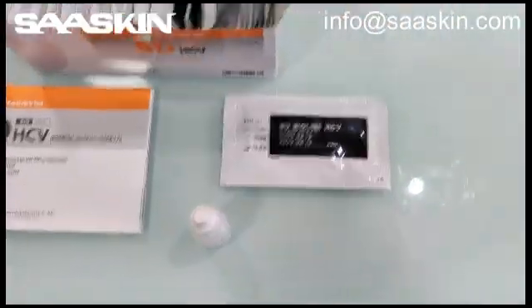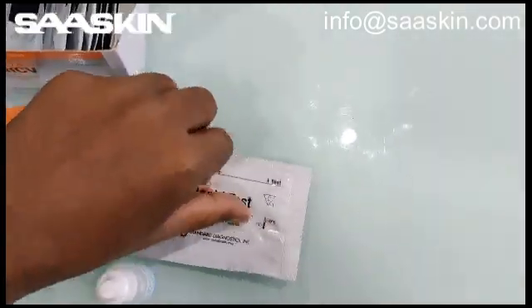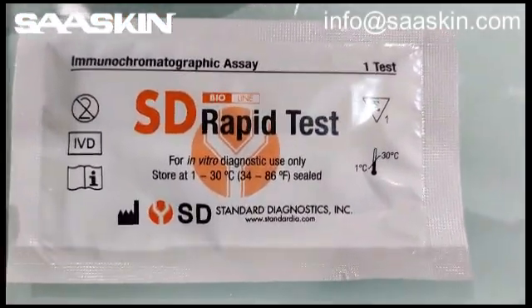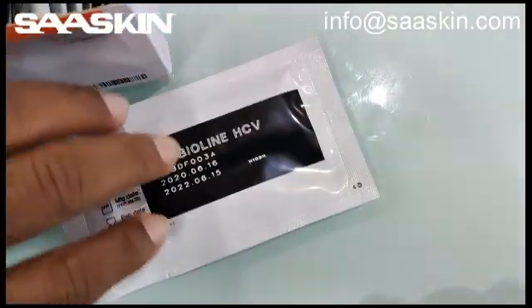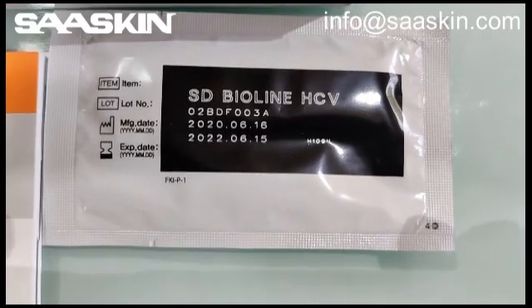Here you go — the test cassettes look like this. Let me zoom in for you — this is how the test cassettes look like. The other side also shows the expiry date; typically these have two years of expiry.